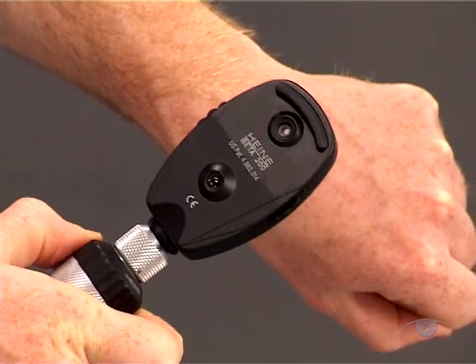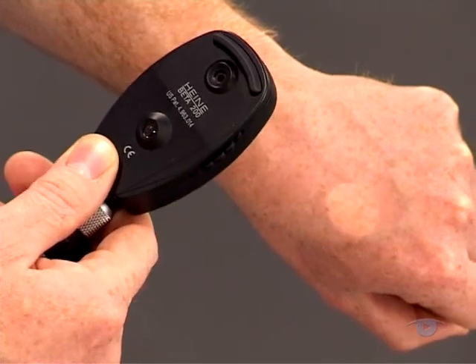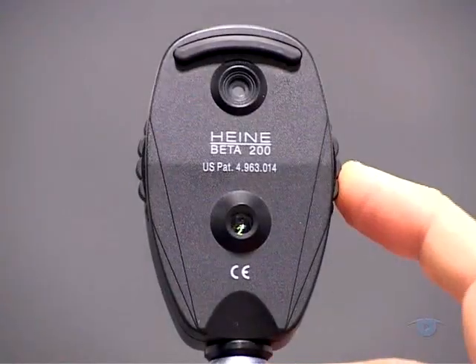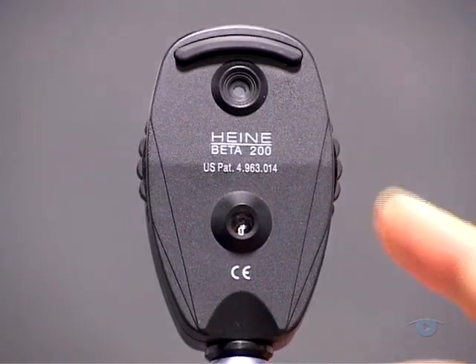To prepare the ophthalmoscope, turn it on and check that it's working. Then select a large round aperture for illumination, and finally rotate the focusing wheel so that it's set to zero. The instrument is now ready to use.